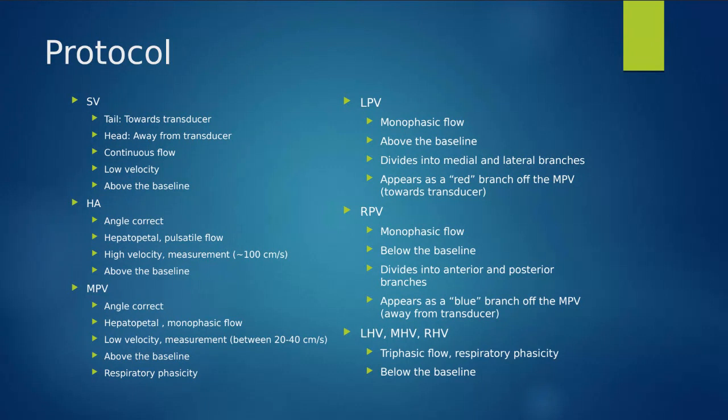Is it going through 3 phases? Is it going through 2 phases? Or is it going through 1 phase and it's not really responding to anything else? Venous flow is typically going to be monophasic, or what we call continuous. It has this continuous flow that doesn't really change in velocity at all.